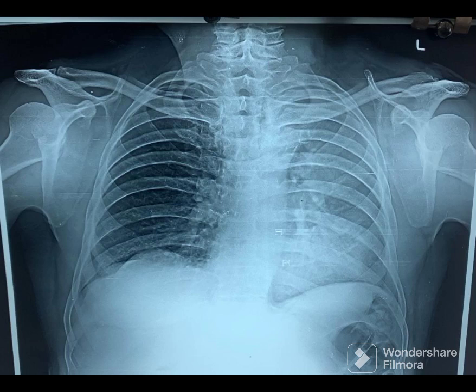Welcome to Chest X-Ray Mastery. You will be given 10 seconds to make your impression. At the end, we will provide the key findings and diagnosis.